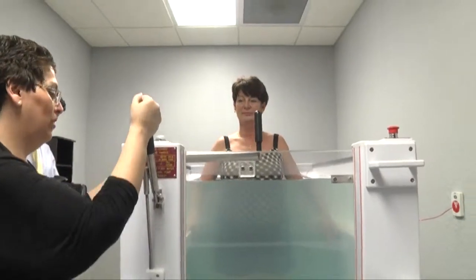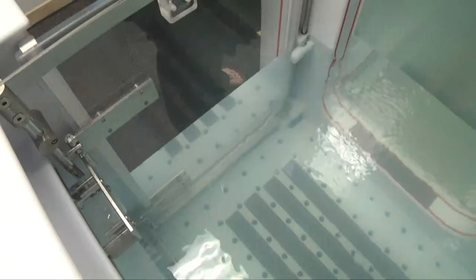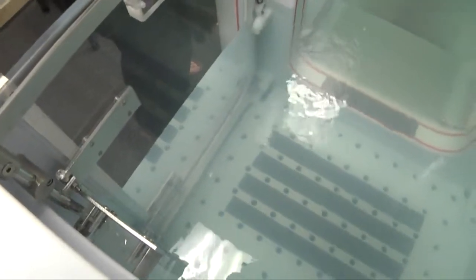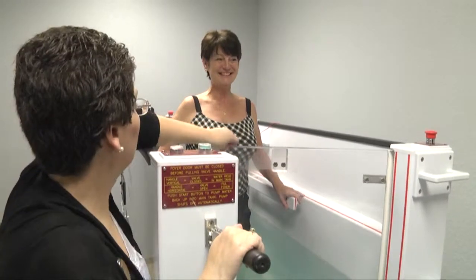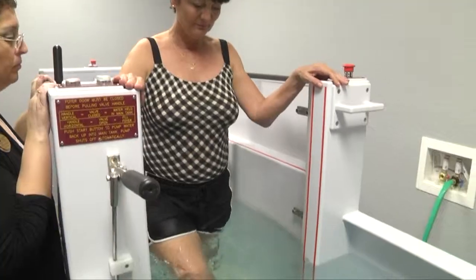The exit is just a reverse — you'll actually pull the lever again so that the water flows back into the foyer area. Once the water is even again, then you can open the main door, allow them into the foyer, and close the main door behind them.